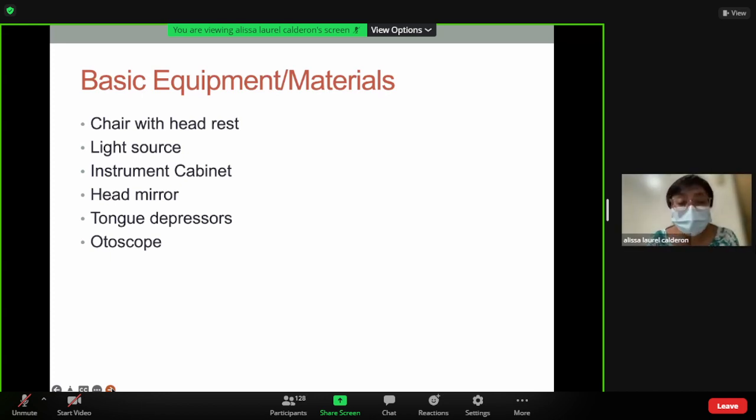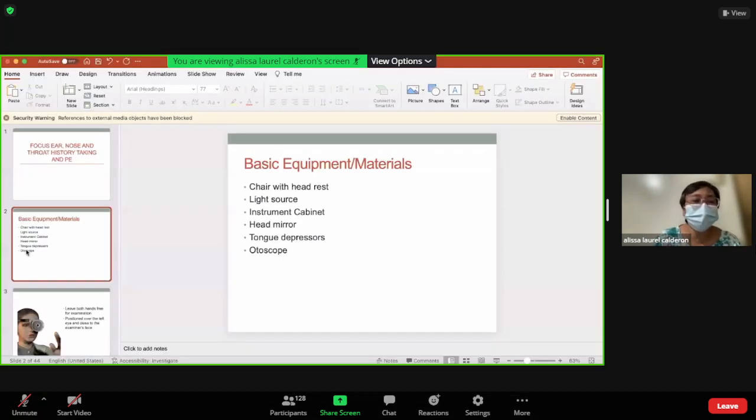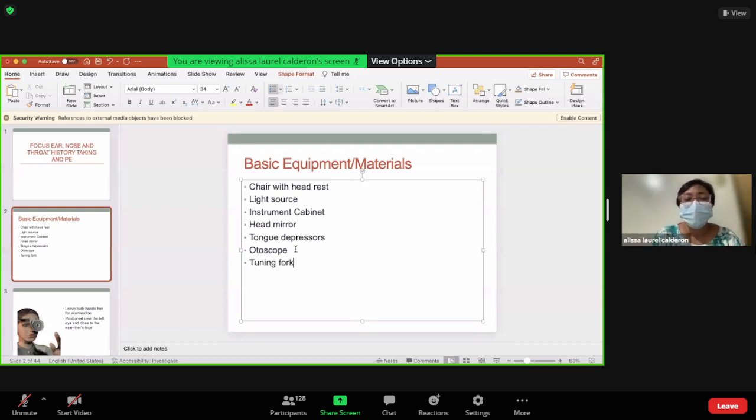You need to have tongue depressors. When you do your rhinoscopy, as much as possible, you have to have your tongue depressor. But nevertheless, it's okay for you to use your tongue depressors. Very important is the otoscope. Okay, I forgot to put the tuning fork. Tuning fork. Okay, and of course your laryngeal mirror for your rhinoscopy.